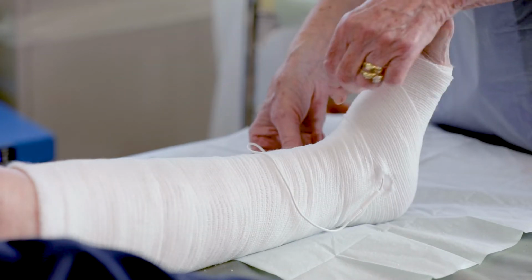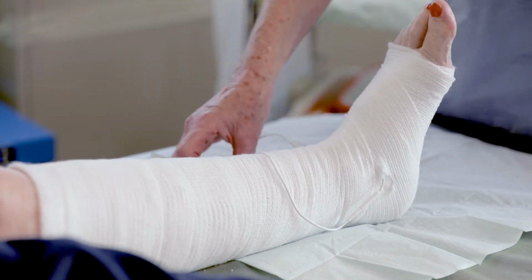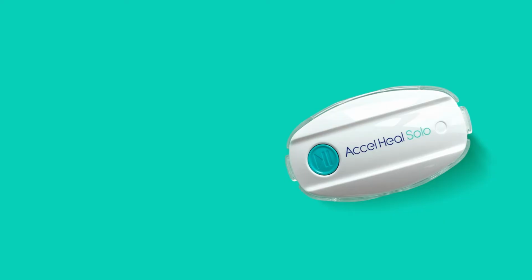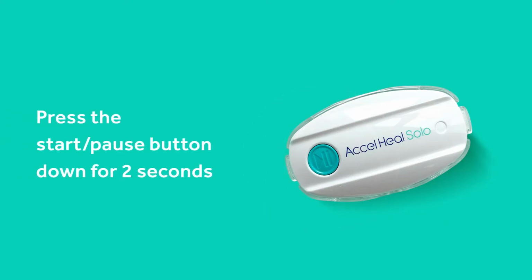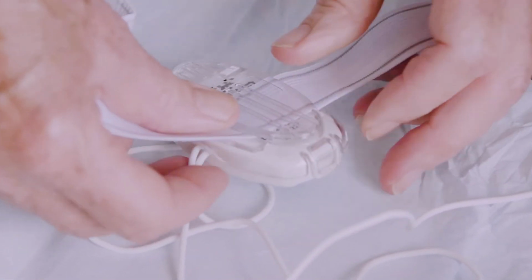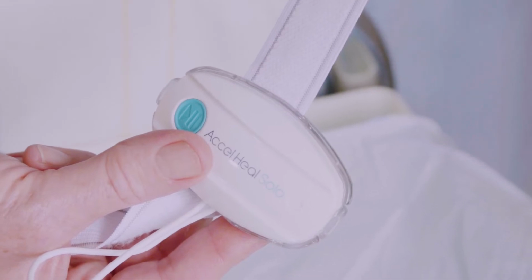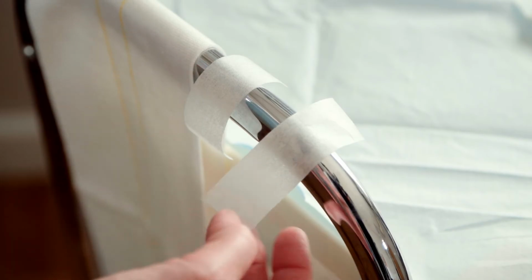Connect the treatment device to the electrode pads by pushing the electrode connectors into the electrode pad receptors. Activate the treatment by pressing the Start/Pause button down for 2 seconds. Secure the device using the provided removable clip and strap, ensuring it is placed away from bony prominences. Secure any free wires with tape.